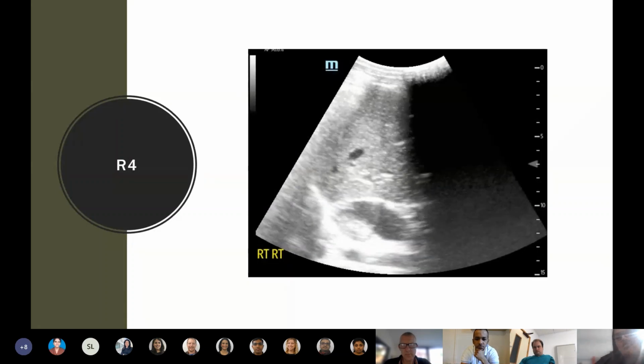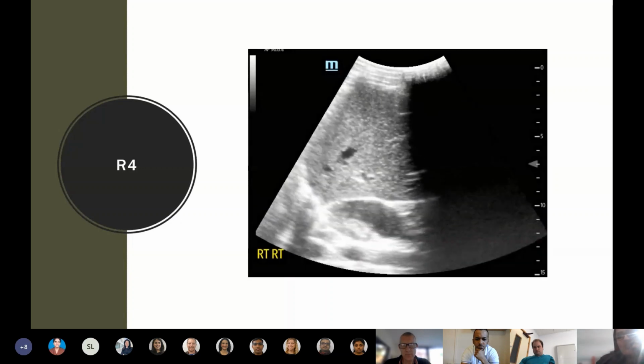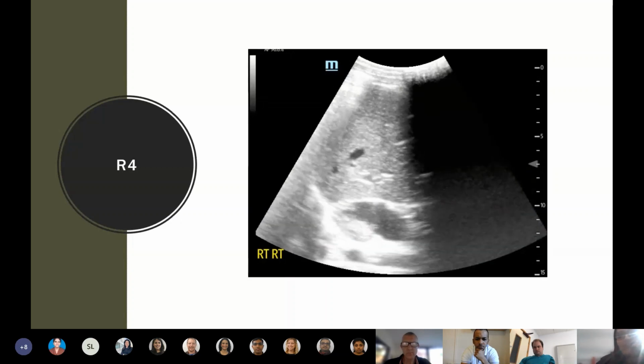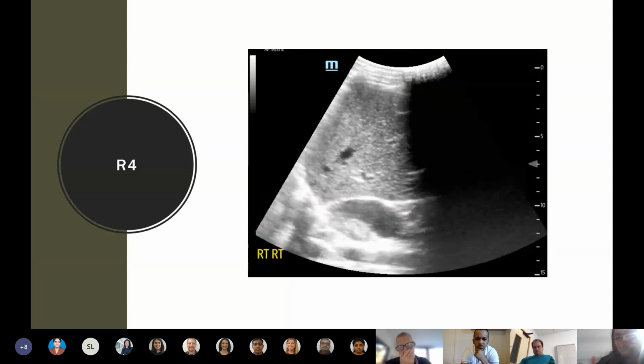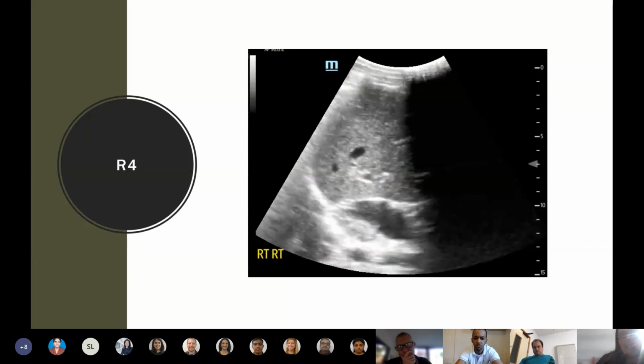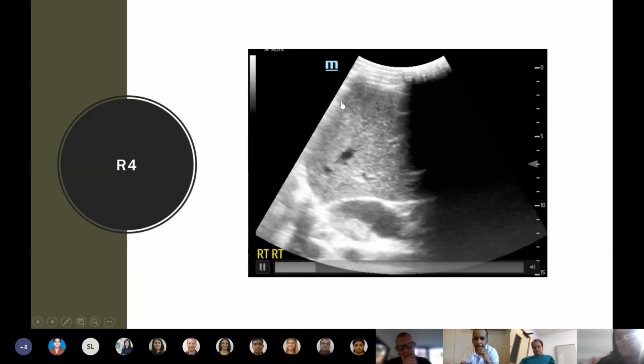And as you know, contrary to what we saw when we came down, where you saw the lung curtain come through, on the right side we couldn't see that as beautifully, and actually the feeling was that what we were seeing on that left is just movement artifact.